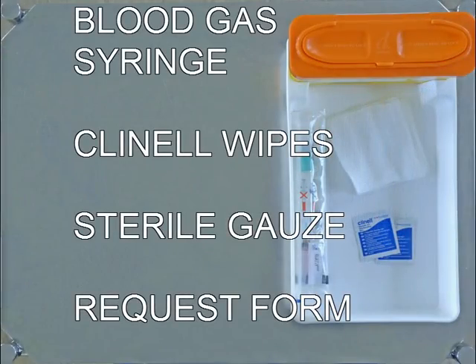Contents include a BD preset blood gas syringe, clenelle wipes, sterile gauze, and a request form.